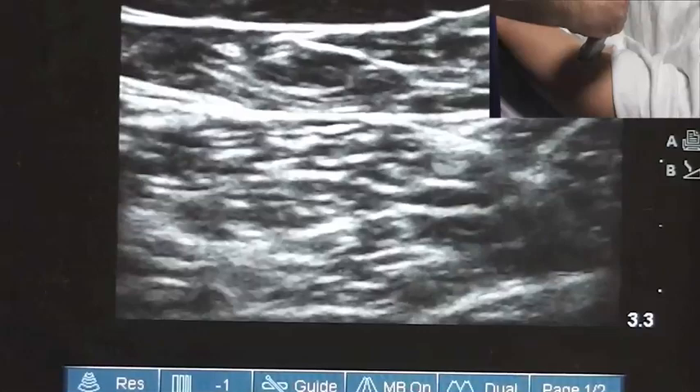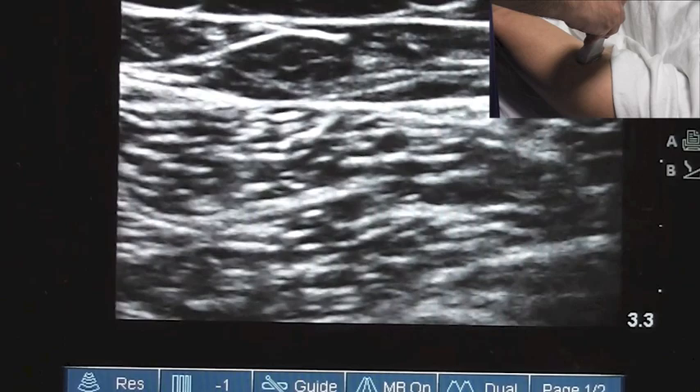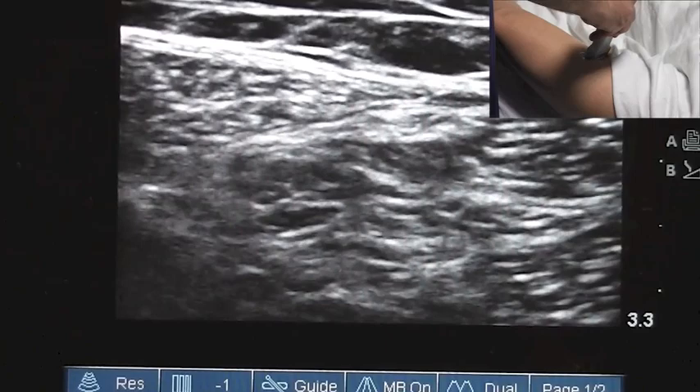To do a saphenous nerve block, we have our patient in supine position. What I'm going to do is take the ultrasound probe and basically place it about mid-thigh. When we do that, we don't see much other than skin, fat, muscle — that kind of thing. What I'm looking for is the femoral vessels. I'm going to scan medially until I can find them. It's important to know this is lateral and this is heading toward medial.